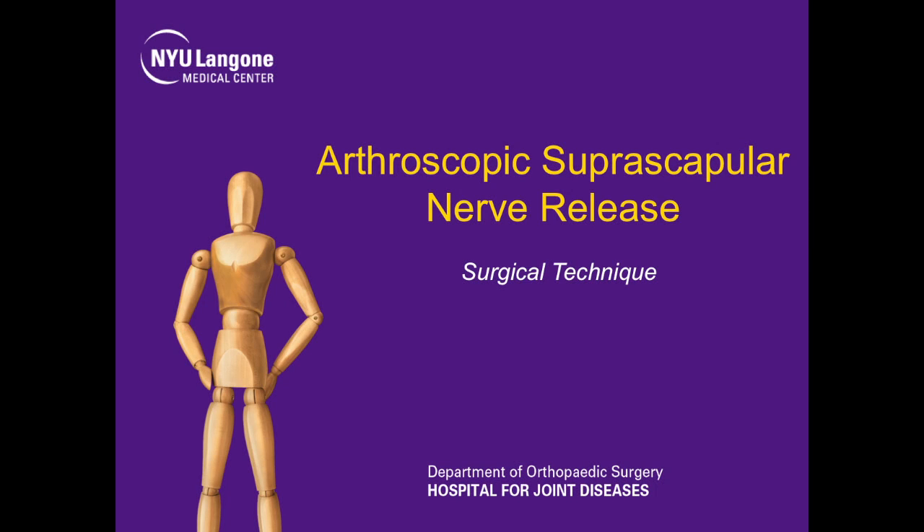This is Dr. Jaz Raoui, Chief of Sports Medicine at NYU Hospital for Joint Diseases. We're going to present our technique for arthroscopic suprascapular nerve release.